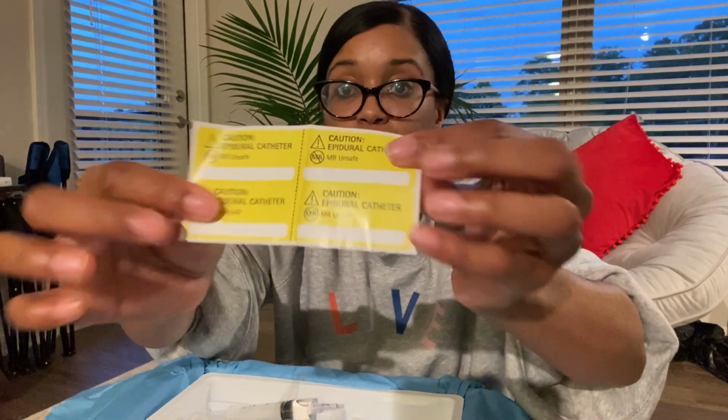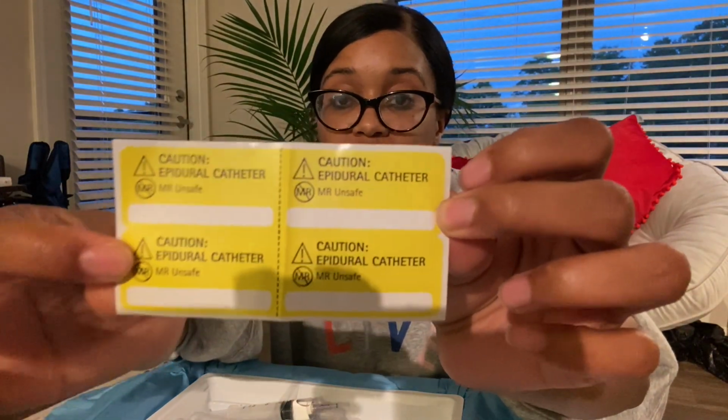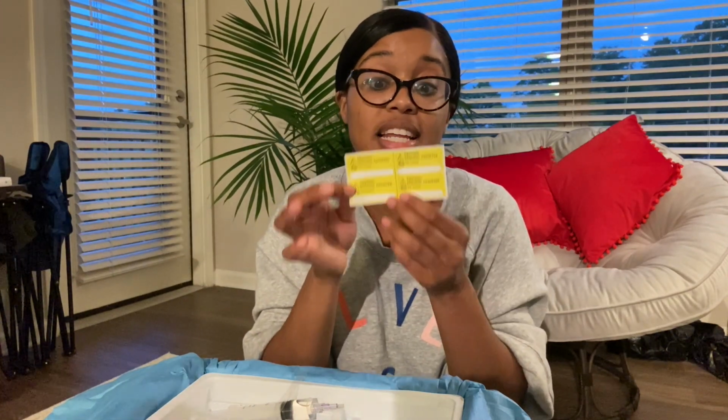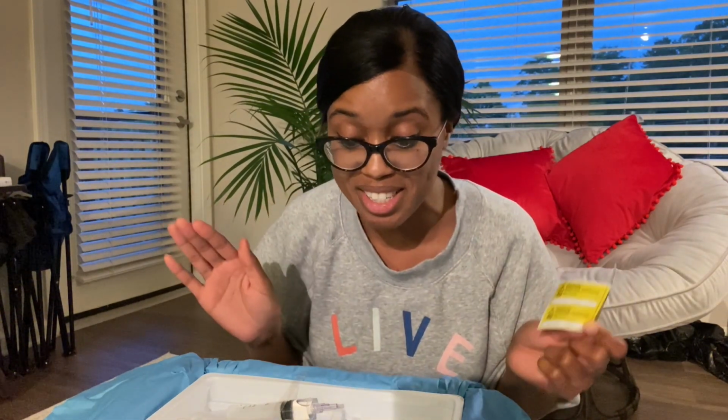Some other things. This sticker is really important. It says, caution epidural catheter. So we put this on the end of the catheter. Once we put in the epidural, we put this sticker on the end of the catheter so people know not to inject medications through it, because we're letting them know this is an epidural catheter. This is not an IV. Do not put any medications in here.